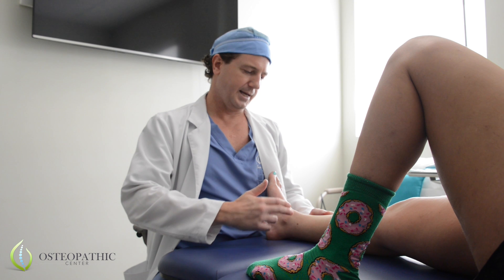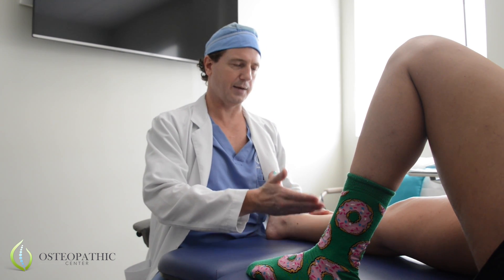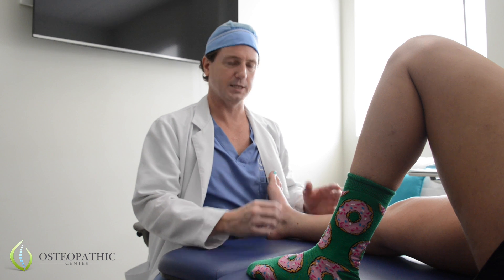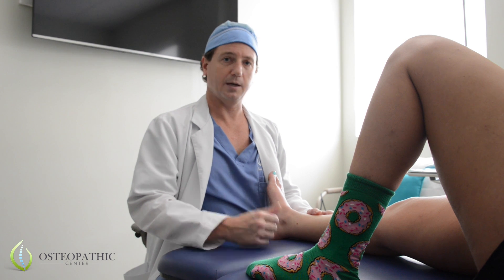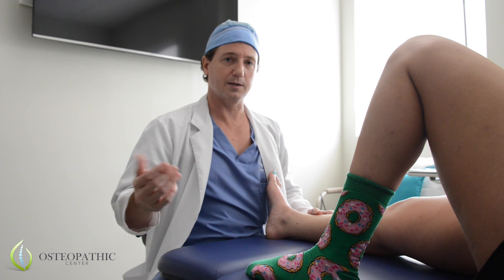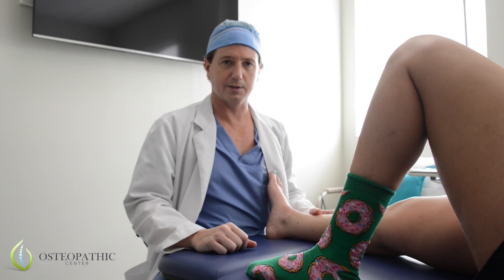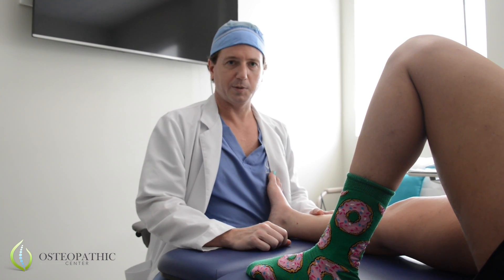Now we're going to further that by injecting lidocaine right to these areas and have her be active. I want to see the pain go away completely, and if it does, that tells us that's the point of injury. Then we re-inject it with some type of regenerative material — there's prolotherapy, there's PRP, there's stem cell which is amniotic tissue allograft, umbilical cord, bone marrow, adipose. All of these are effective; stem cell products are the most effective and will help to regenerate this tissue and get her back to training.